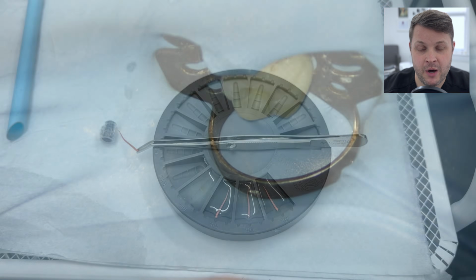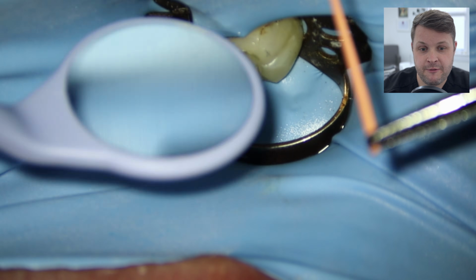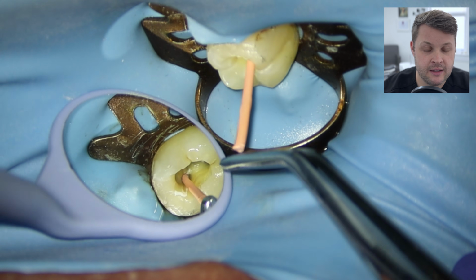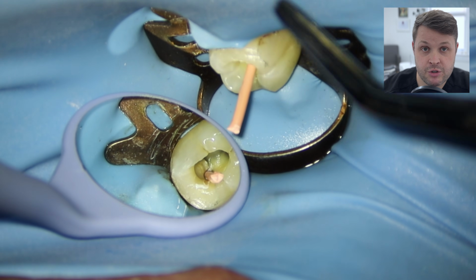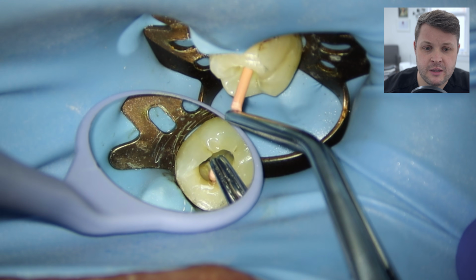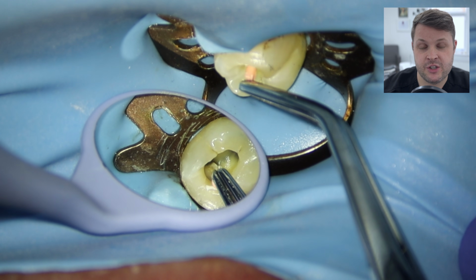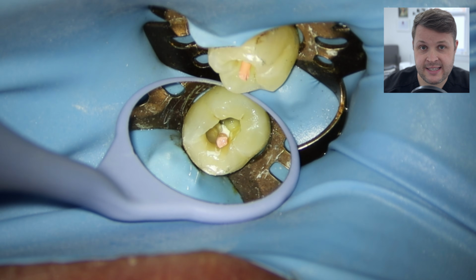We're then going to pick up our locking tweezers with the GP point, and we're going to very, very slowly and gently push this GP to length. We're not going to ram it down because obviously there's a risk of extrusion and also vapor lock, so it's going to be very, very gentle. The high flex GP cones are quite thick, so there's a real significant risk of vapor lock. And then we just cut off the excess.